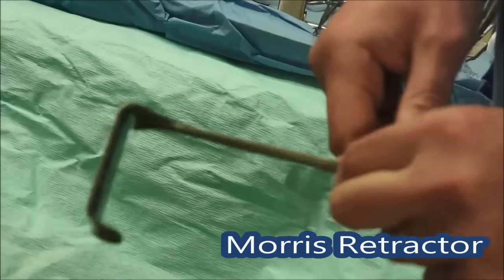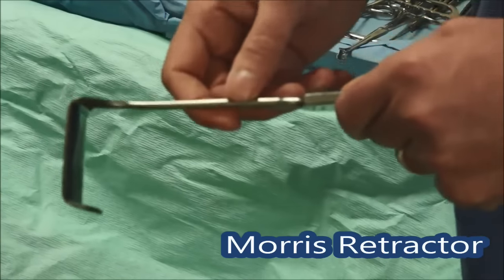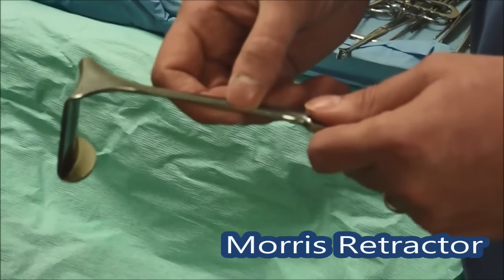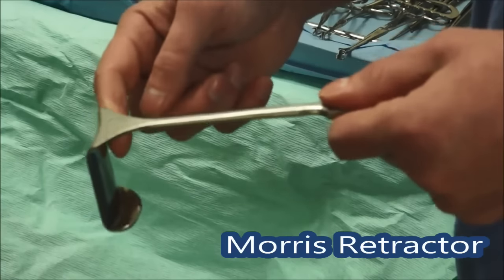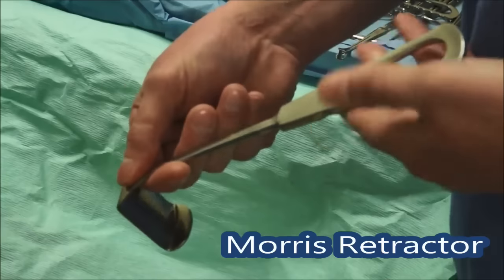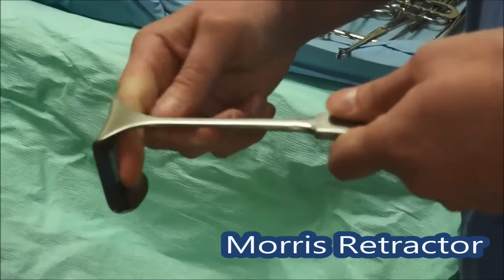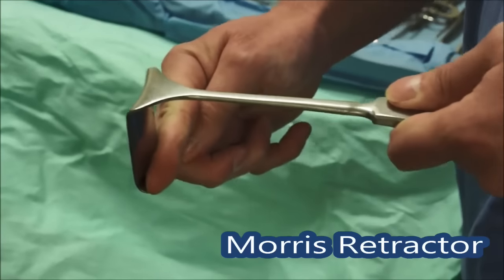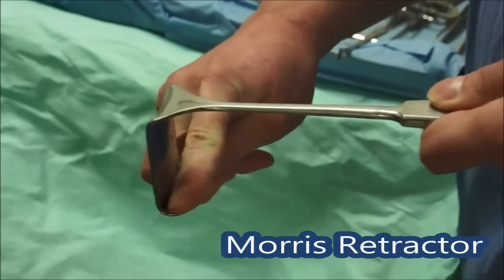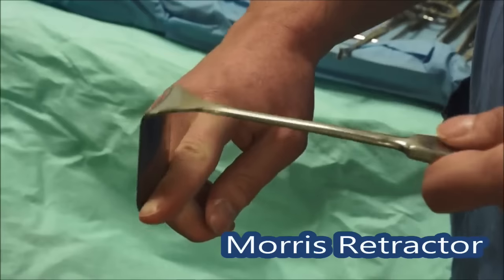For slightly further inside, for a slightly bigger patient or getting into a wound, these are called Morris retractors. Very similar to the Langenbeck, with a slightly smoother textured grip down the side to hold on to, and again with a lip to get underneath the tissue and pull it backwards — very effective retraction.